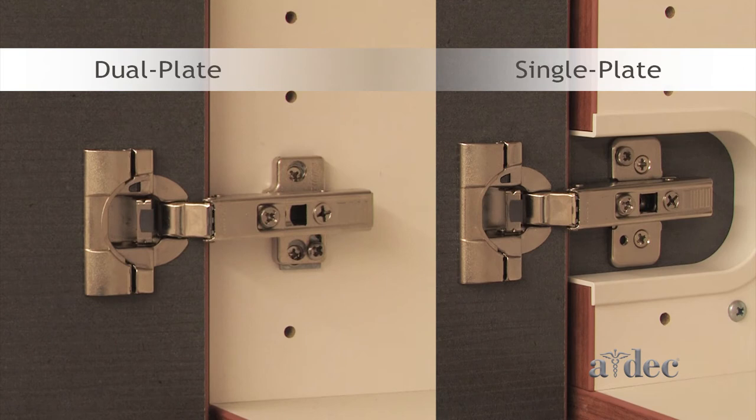There are two different hinge plates with different adjustments to move doors up and down.